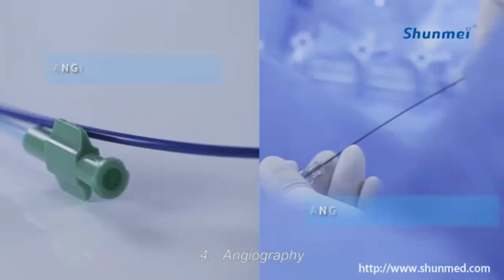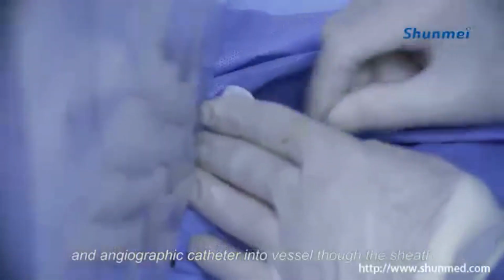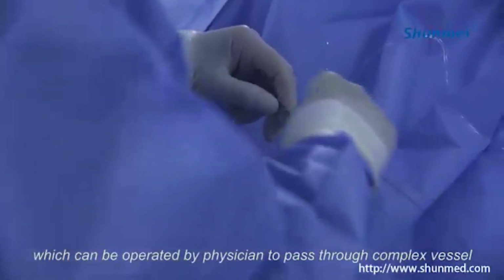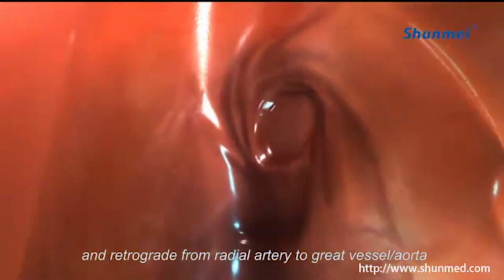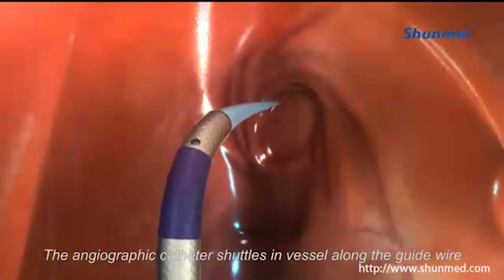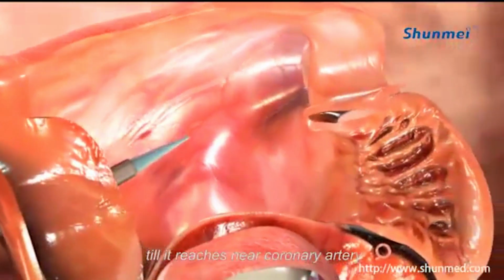4. Angiography. Insert the angiography guide wire and angiographic catheter into the vessel through the sheath. The guide wire is a flexible and steerable device which can be operated by the physician to pass through a complex vessel and go retrograde from the radial artery to the great vessel and aorta. The angiographic catheter shuttles in the vessel along the guide wire until it reaches near the coronary artery.